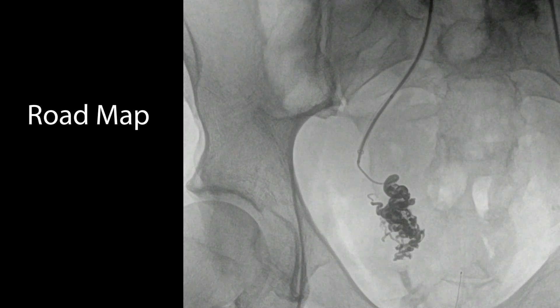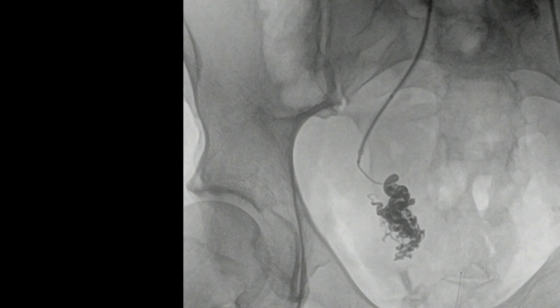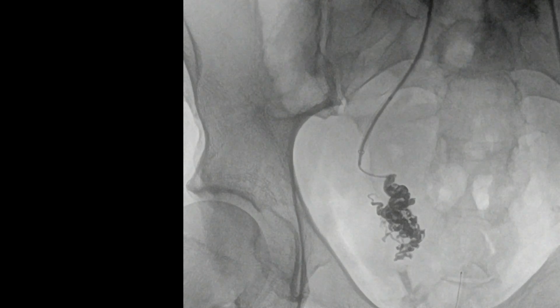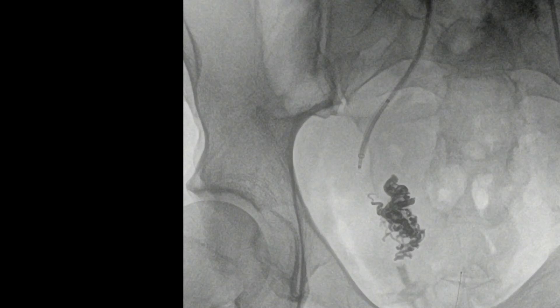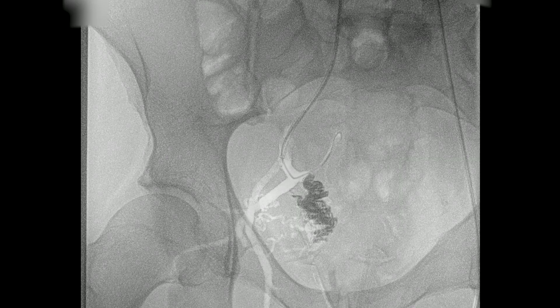You only get one shot with each of these catheters. You need to have multiple microcatheters — once you pull it out, you have to use a new one. This is what it looks like without the roadmap on — really beautiful embolization occurring here. When pulling the microcatheter, do a fairly snappy pull, and aspirate the diagnostic catheter just in case it pulled some onyx into it. Now you can see we've completely taken out that branch.